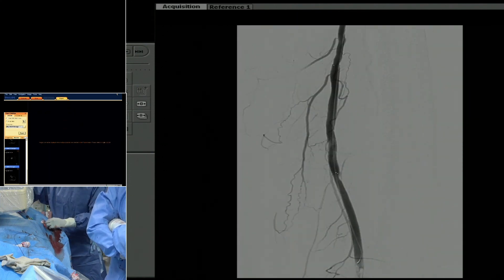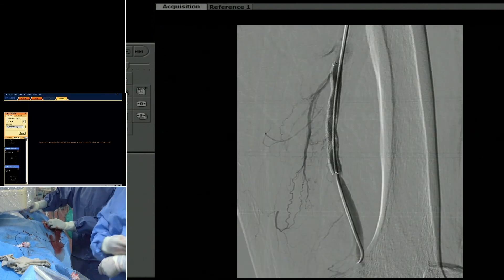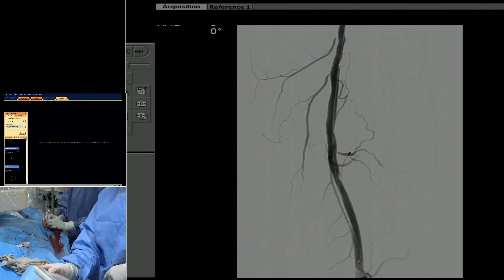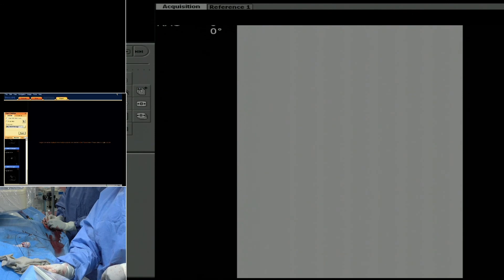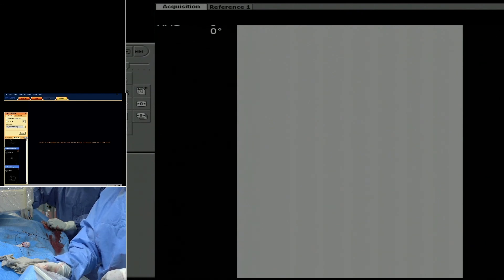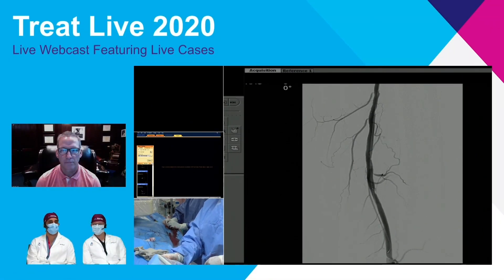It looks much better. I think there is a proximal problem — do you see that contrast still a little bit hung up? I agree. Once we pull our sheath back and dilate that proximal segment, I think we'll be okay. Thanks a lot, Rami and Dan and Omo — good work here.